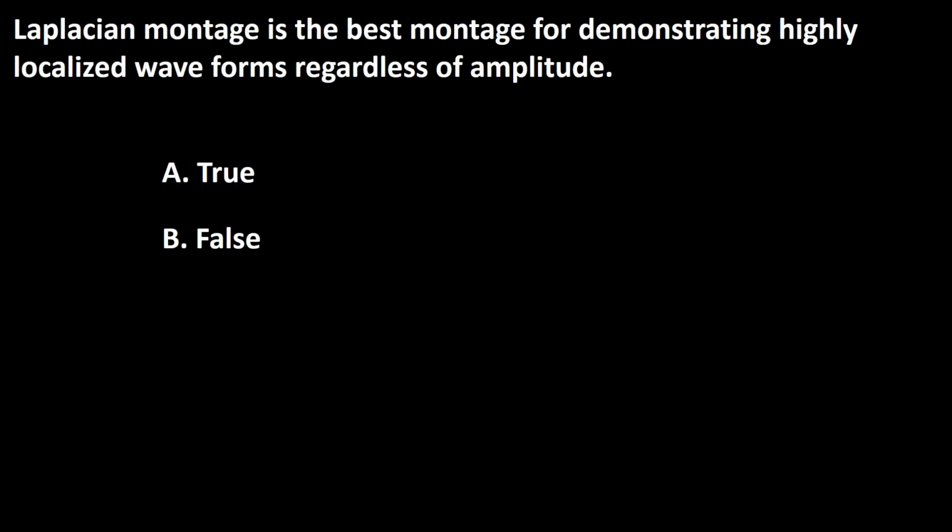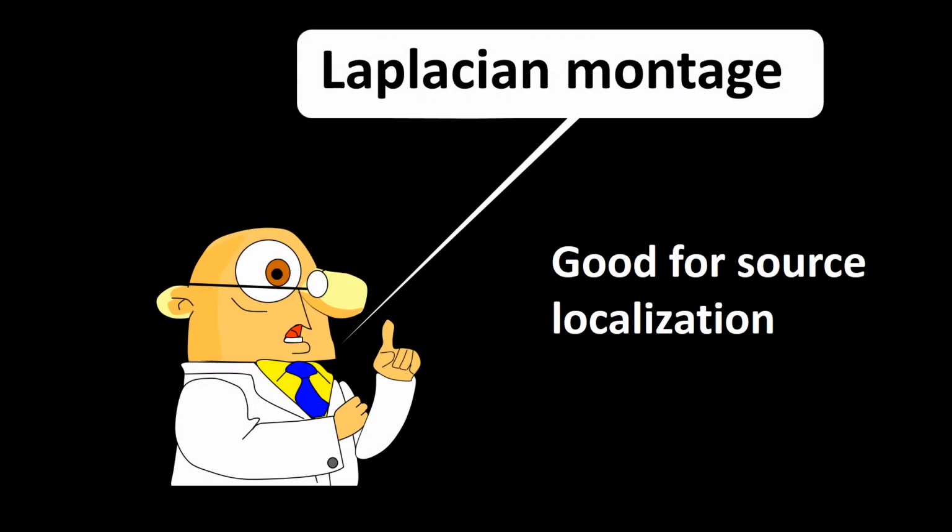Next question. Laplacian montage is the best montage for demonstrating highly localized waveforms regardless of amplitude. A true, B false. Laplacian montages are good for localization. As a matter of fact, they are excellent for localization, to the point that they are often called source localization montages.